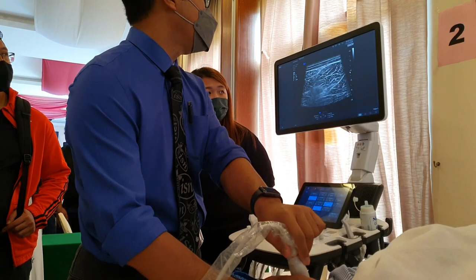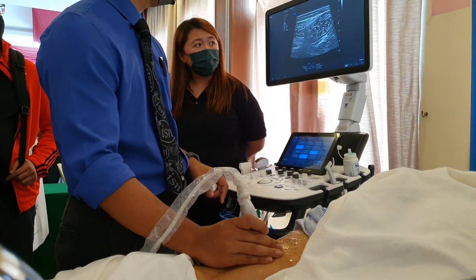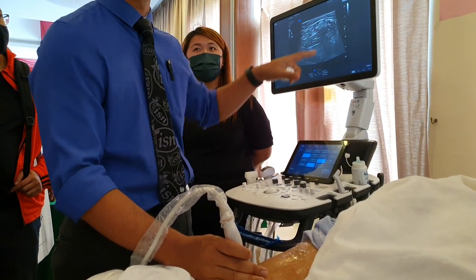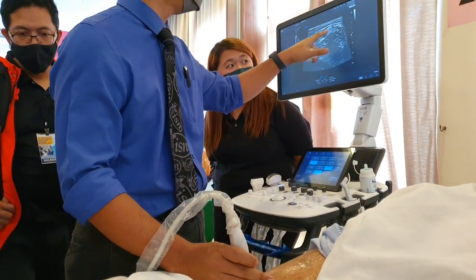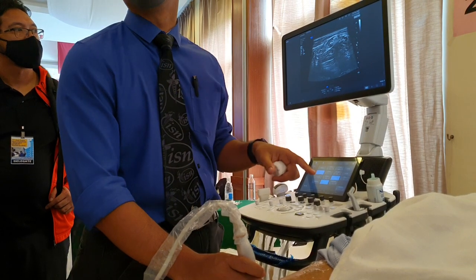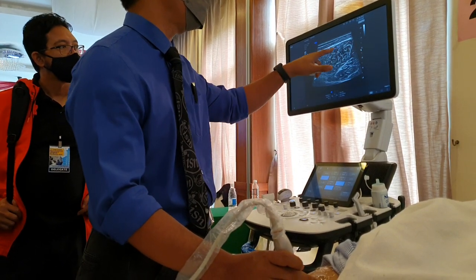So the easier way to do it is you just go down, and then you see that it becomes what? It becomes an egg. Okay, this one you imagine. This one is an egg, this one is a bowl. Okay, egg is semi-T, bowl is semi-M. Can? Okay.